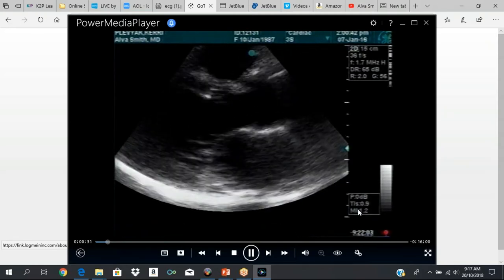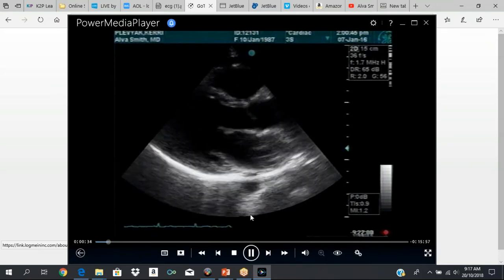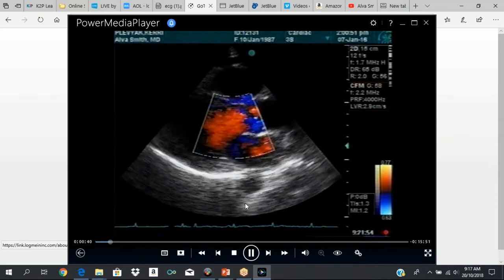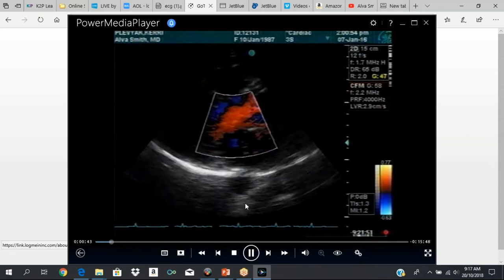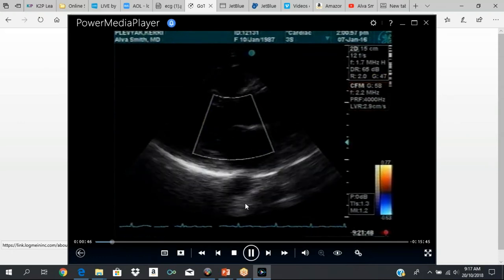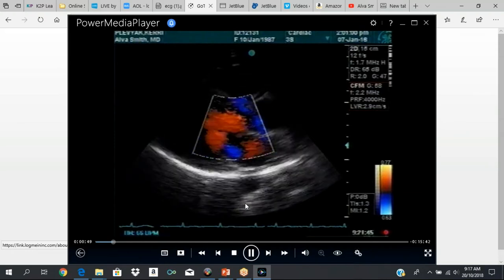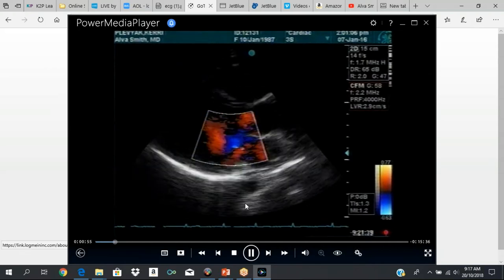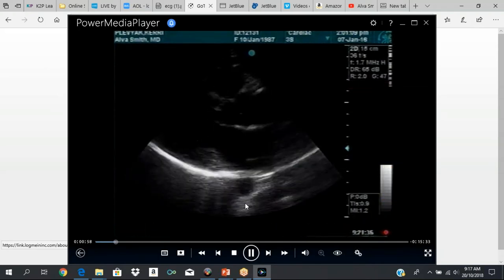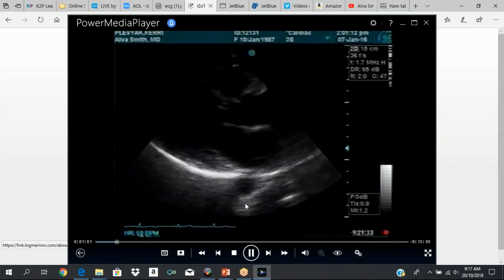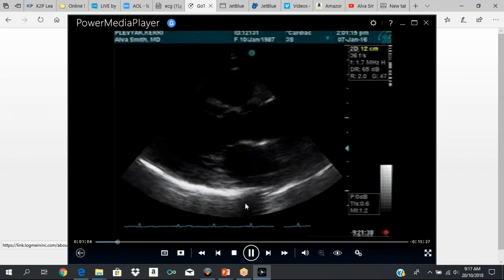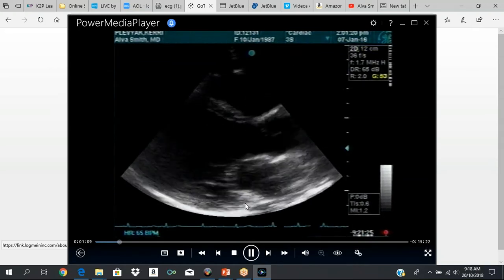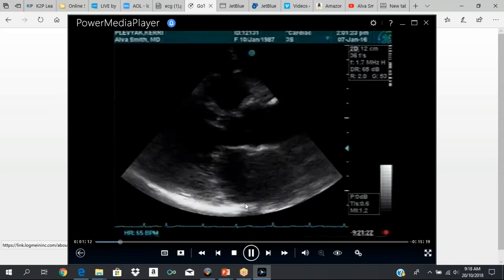This is the parasternal long axis view. When you do your scan, try to get at least a minimum of 10 beats of each view. You don't want to let it go on forever — a minimum of 10 beats of each view. If there is pathology or some abnormality, you might want to get a little bit more, but 10 beats is a good sample size.